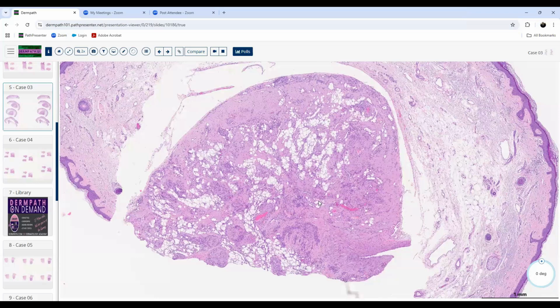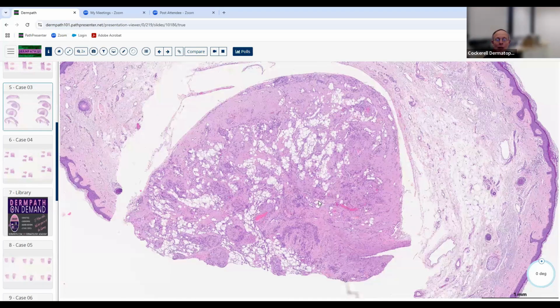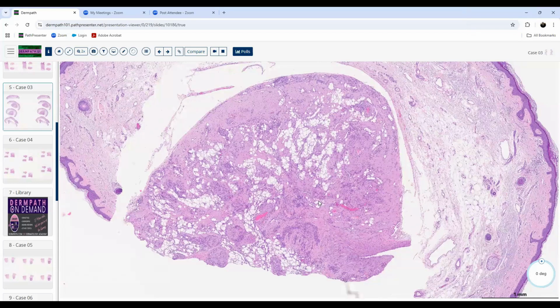Vascular, potentially. Well, not sure. That sort of goes down the realm of other, if you will. But the other main third one we think about is maybe neural. Neural, good. Those three, just very simple: neural, fibrohistiocytic, smooth muscle. Then we're going to look and see if we can tell which one of those three it is.